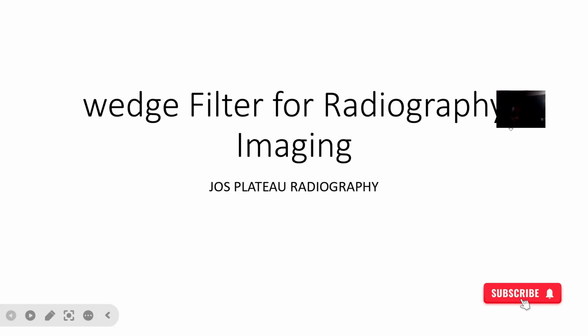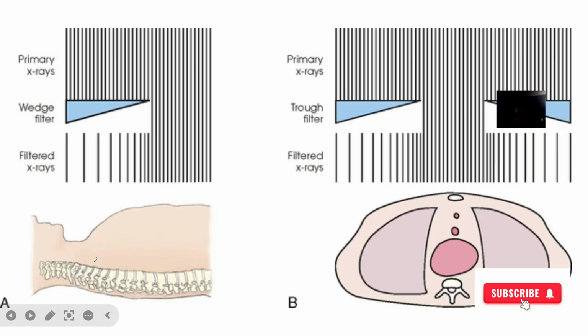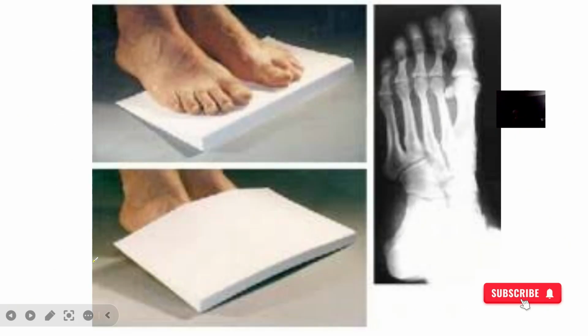Now we look at another study, another practice. This is in radiography, and this is the aspect of the wedge filter. So we're trying to look at what a wedge filter is and why you use a wedge filter.